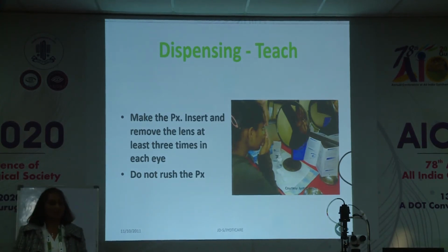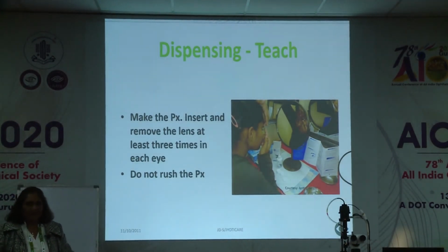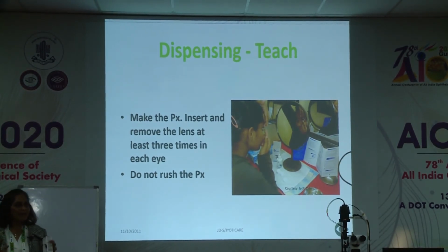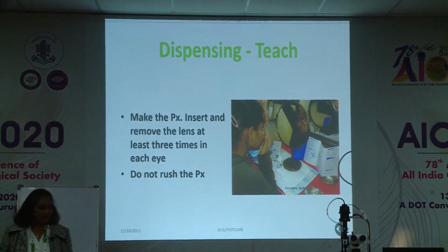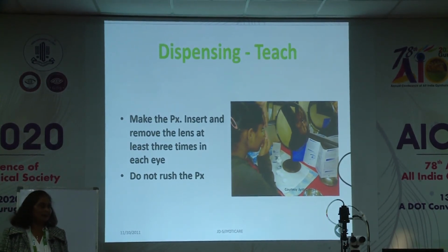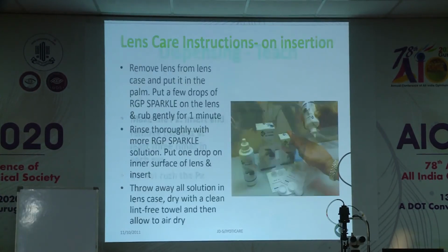You must not rush the patient when you are teaching them insertion and removal. Remember, these are irregular cornea patients and they are quite frightened. In fact, they are quite tensed up. And by making them relaxed, you will find that they will learn insertion and removal much, much faster. In my clinic I have a designated person who teaches them how to take them out. They can take as long as they want. There is a little area in which they do insertion and removal, and they can take as long as they want. There should be no problem. But this is very, very important.